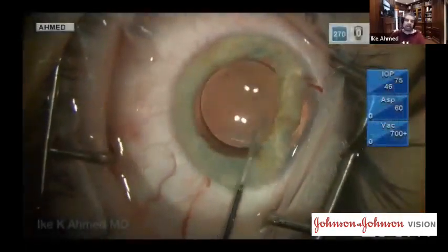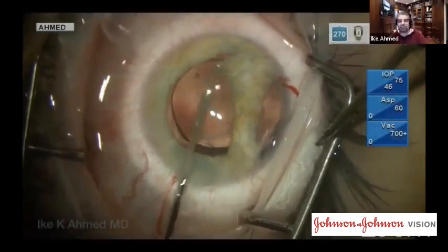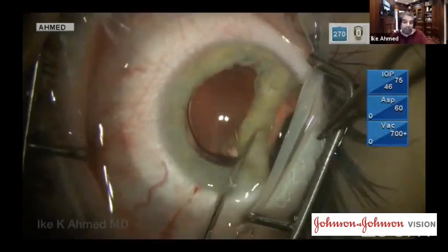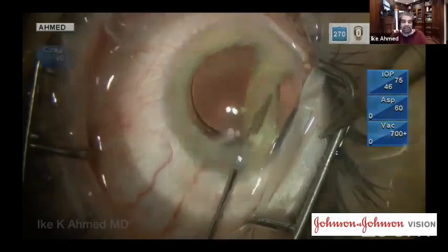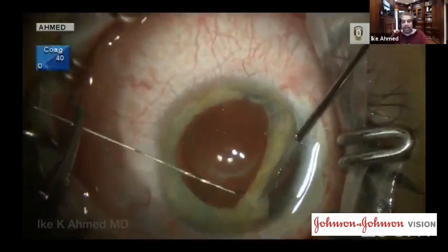Now, there are conditions like this where we have to consider we also have an iridodialysis present. These conditions can also be managed with the cerclage suture. Priya very nicely showed various iridodialysis approaches. You can see this is just a little less than 90 degrees in size, just under 3 clock hours.